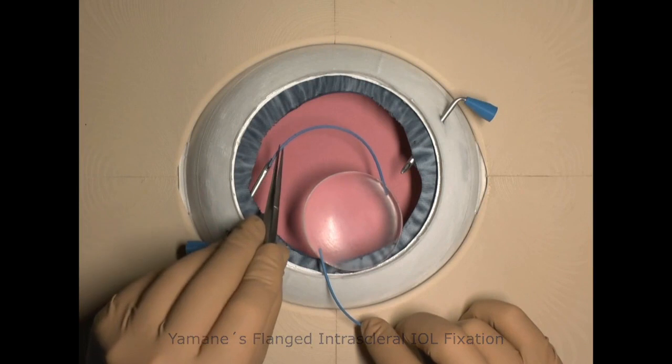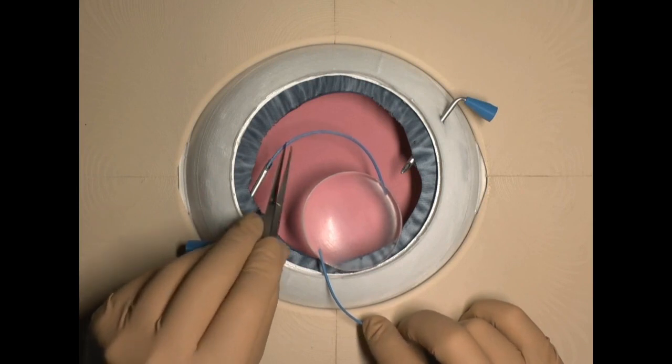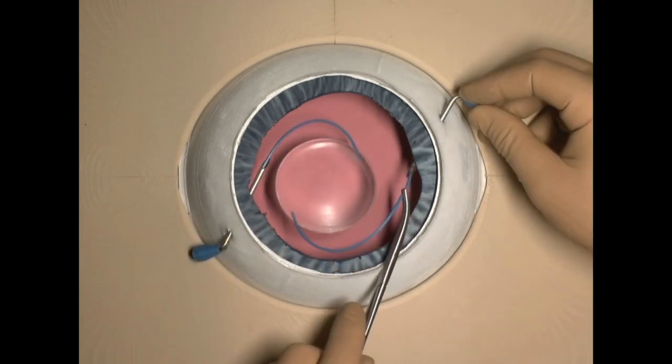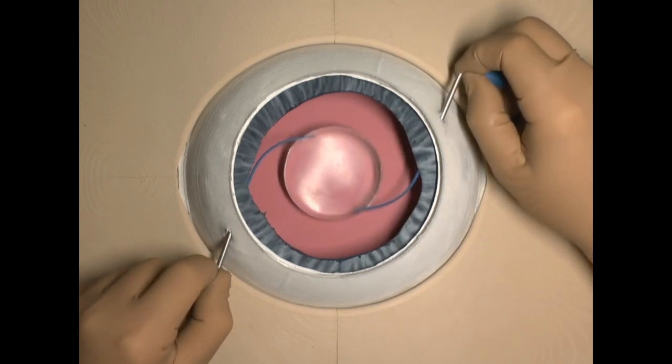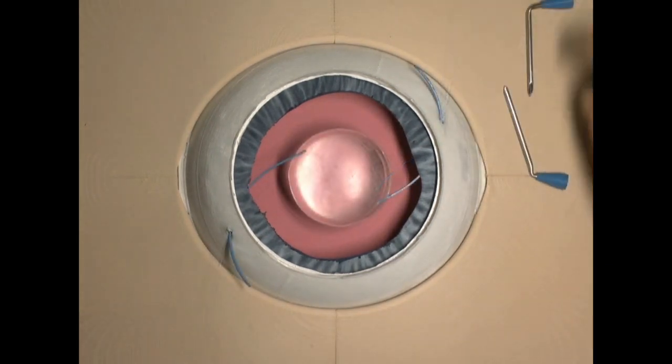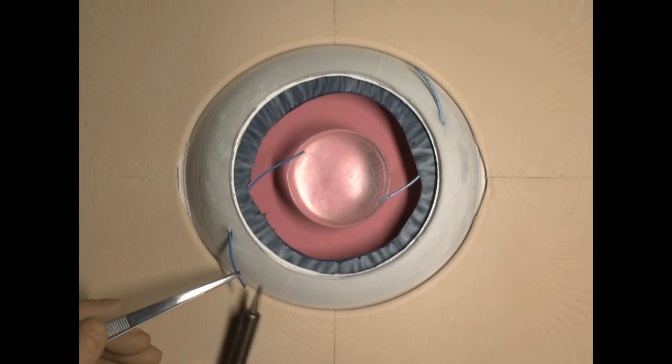In this technique, the haptics are externalized using needles and the tips are melted by cauterization without directly touching them.